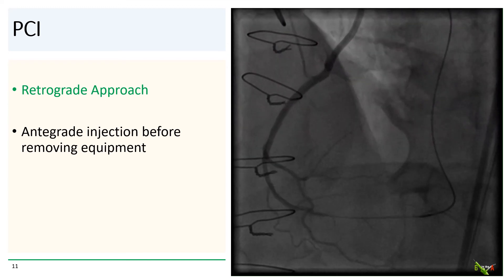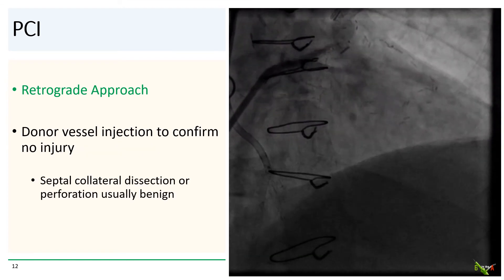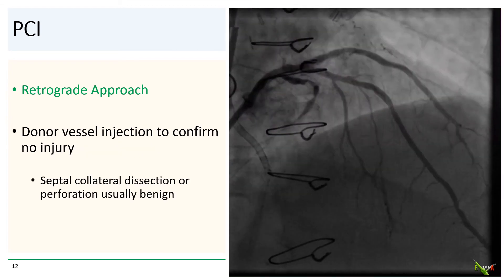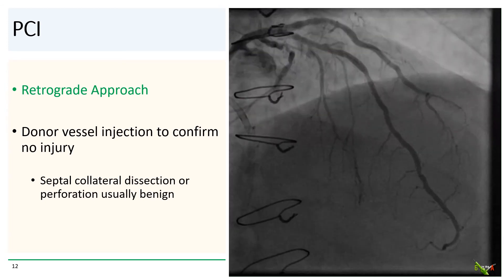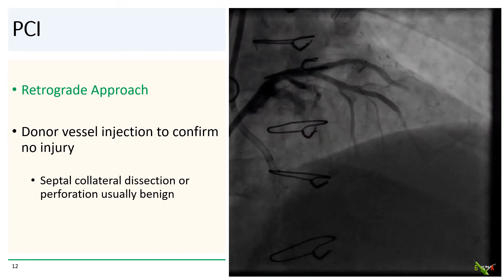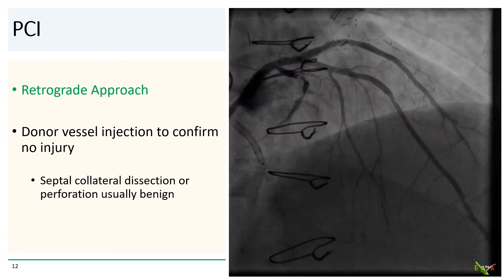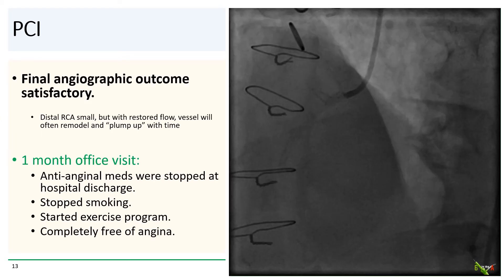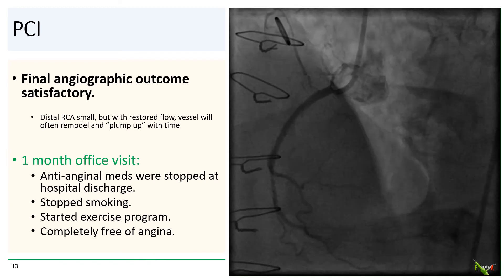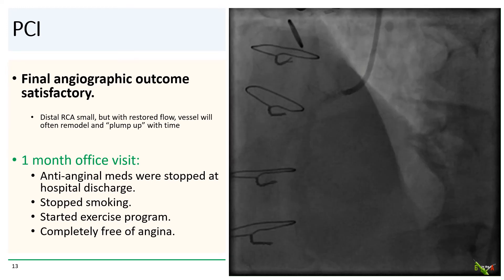We obtained a reasonable result after laying down two stents from the proximal to mid-RCA. We always inject the donor vessel to confirm no injury. In this case, the left main and the LAD were both fine. There is a bit of injury to the septal collaterals, but dissections and even perforations in the septals are usually fairly benign. The final angiographic outcome was quite satisfactory. The distal RCA is small, but with restored flow, the vessel will often remodel and plump up with time.